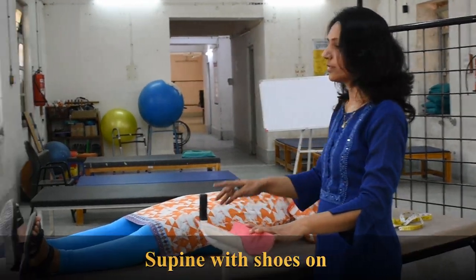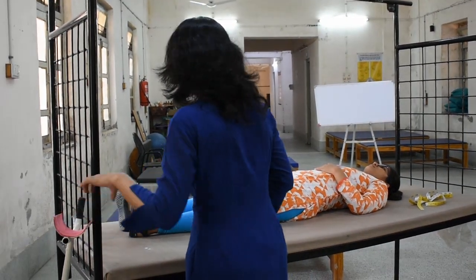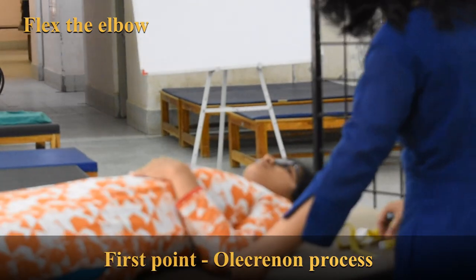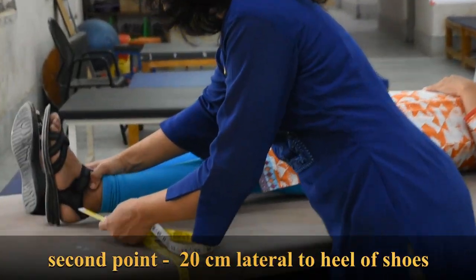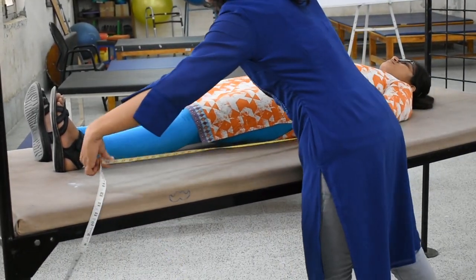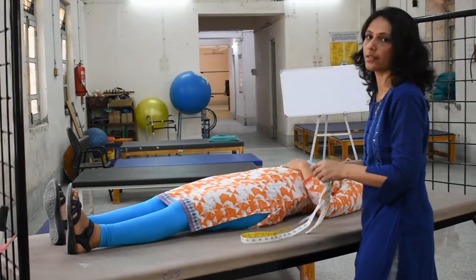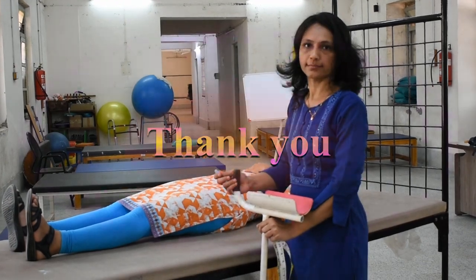For the measurement of the gutter crutch with patient in supine position with shoes on: we flex the elbow of the patient, and the point of the elbow — the olecranon process — is the first point. The second point is 20 cm lateral to the heel of the shoes. From the point of the elbow to a point 20 cm lateral to the heel of the shoes, here it is coming to 43 and a half inches. That is the measurement for the gutter crutch in supine position with shoes on.